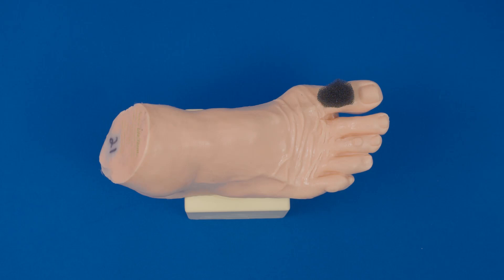Many times, the sandwich technique is appropriate, especially if the wound is from an amputated toe or if it is in between the toes.